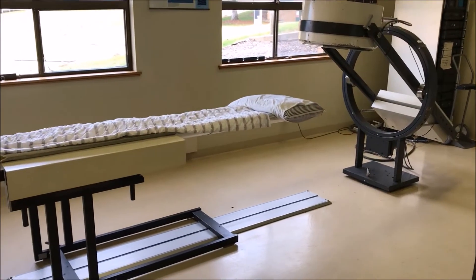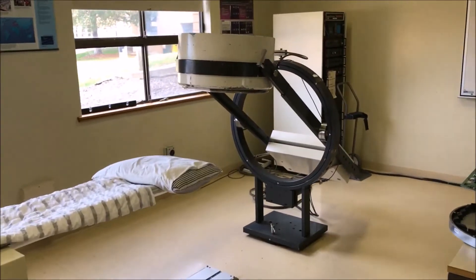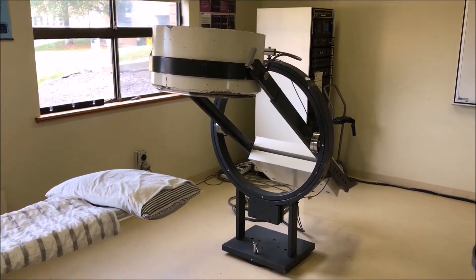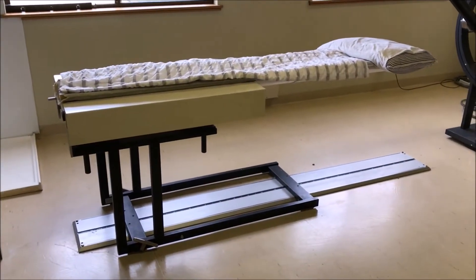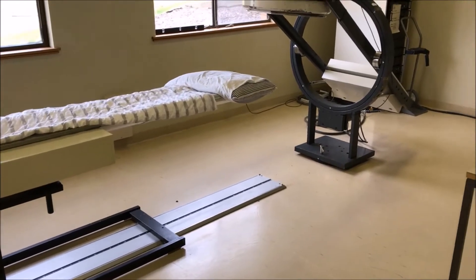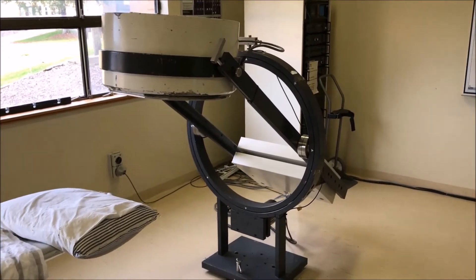We're going to talk about different types of gamma cameras and how the camera operates. This is an old GE — it's about 30 years old, the one at Charles Sturt University. These were state-of-the-art in their day and you can see that it takes up quite a bit of floor plan. There's a table or bed that the patient would lie on and that would move in through the gantry of the gamma camera itself.